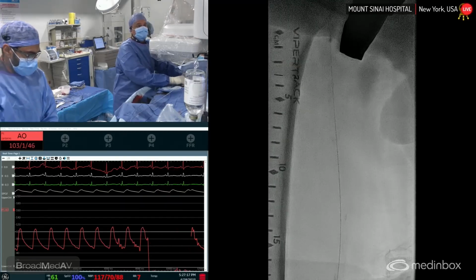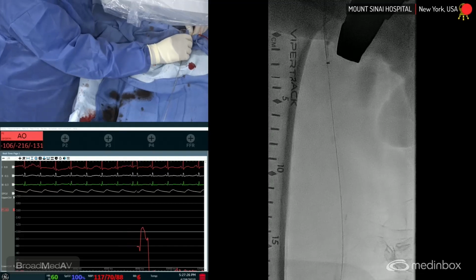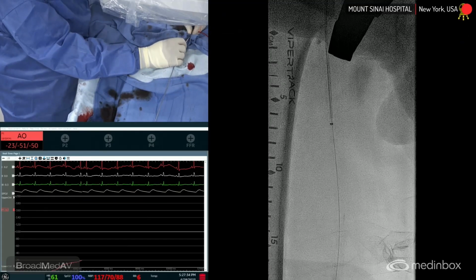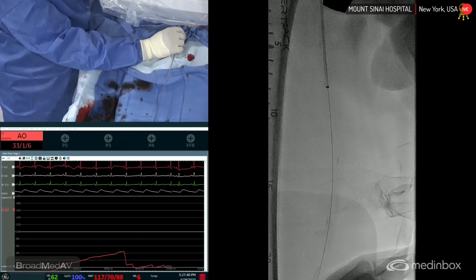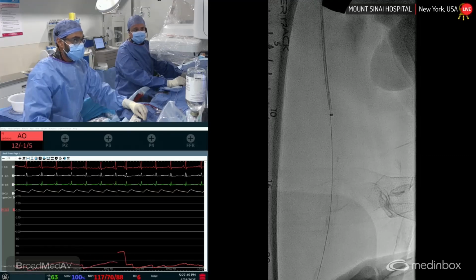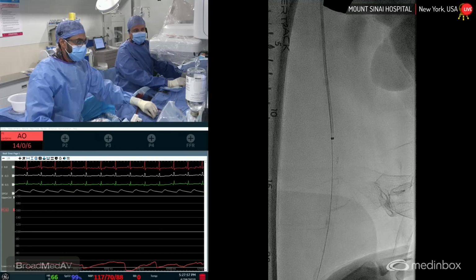And at this stage, we feel that we can do any sort of intervention here, whether it's balloon angioplasty, spot stenting, or focal atherectomy followed by stenting. Okay, turn it on, please. So we're just going to do this slow aspiration of the lesion. Let it do the work. It doesn't aspirate straight blood, and because of that, it's going to look like you have a lot of blood inside the container. It's about two-thirds to one-third, I guess, saline to blood. So therefore, it's really the technique of aspiration that's very, very important.